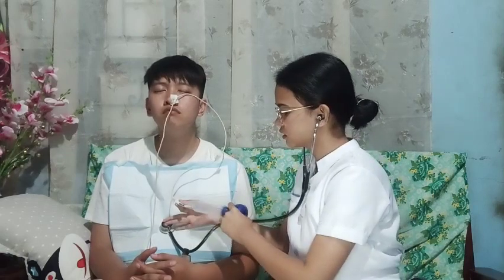I'm going to put air, and then check for the whooshing sound. Then, I will now aspirate. After I confirm that the NGT tube is in the right position, I will aspirate to check the stomach contents.